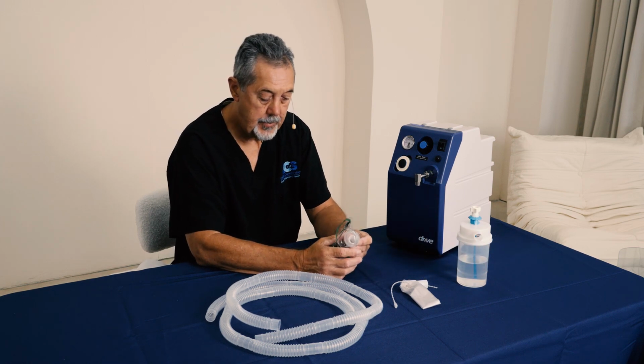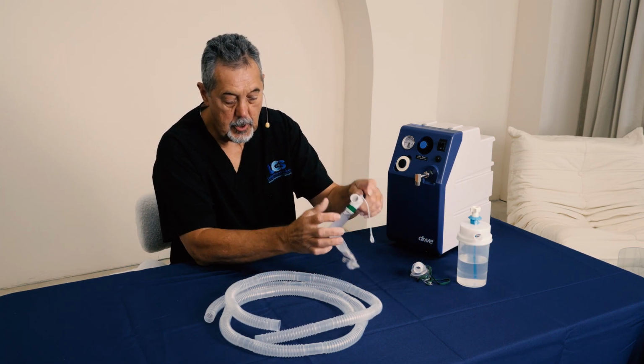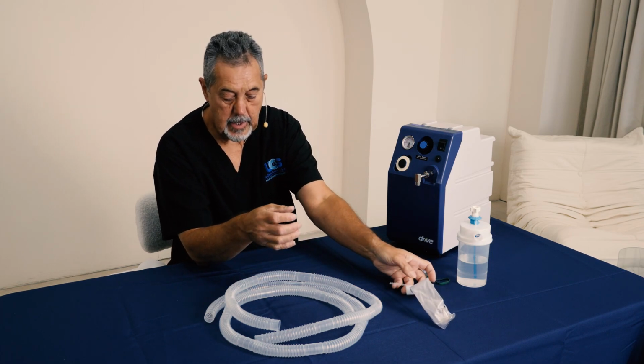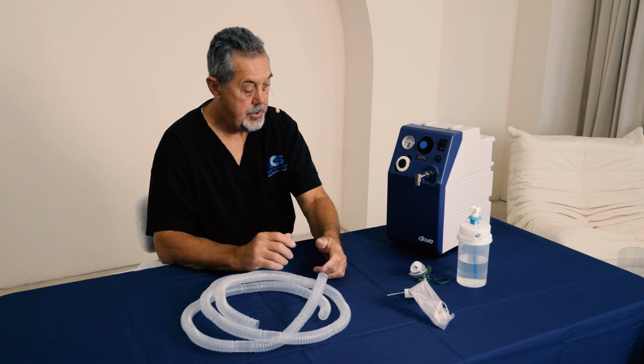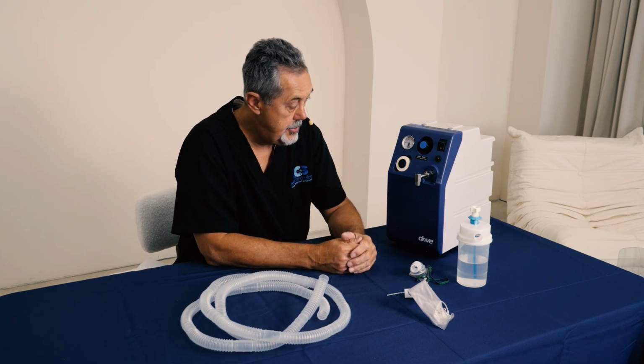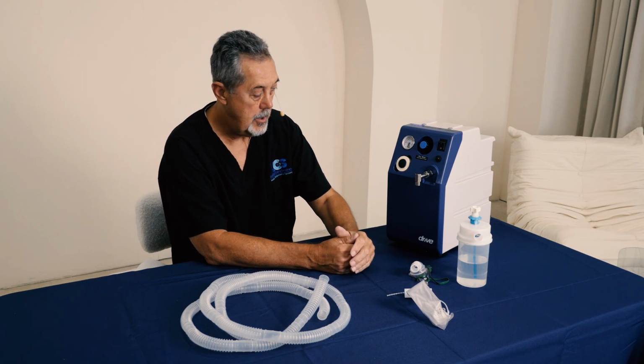We're going to need a tracheostomy mask. We're going to need a drain bag. And we're going to need some corrugated tubing. So, in order to adjust the pressure on the compressor, everything needs to be hooked up.